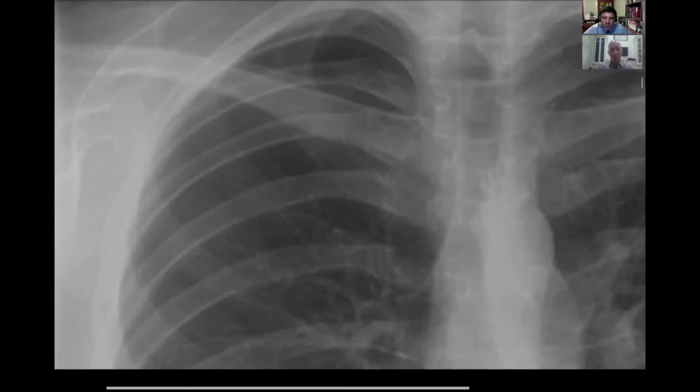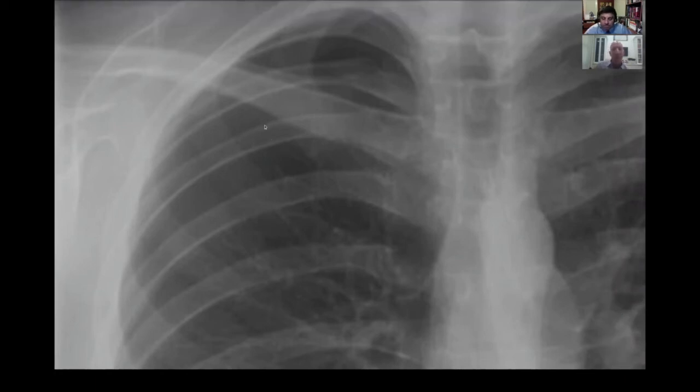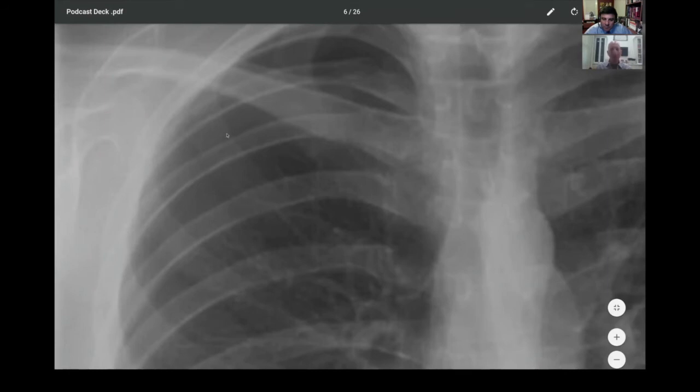So this is the same case. I just zoomed it up a little bit here to try to accentuate what you described well as this white line here. This is the pleural margin, and if you look at it really carefully, you can see all it is is a white line that extends down here. And this is the most important thing to notice when you have a pneumothorax, because the paucity of lung markings could be due to bullous disease, blebs. You can sometimes have an artifact called a companion shadow artifact from a rib, which looks like a black line that can often be confused with the pneumothorax. So really, you want to see not only the paucity of lung markings, but make sure that you identify this white pleural line here.